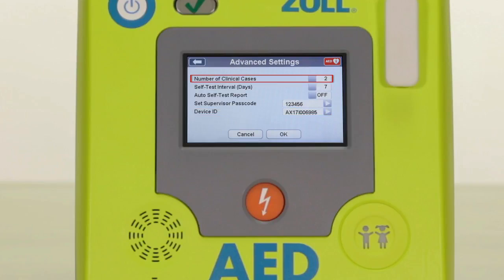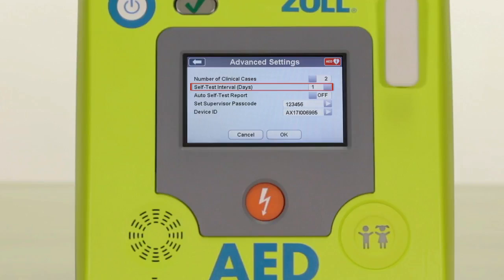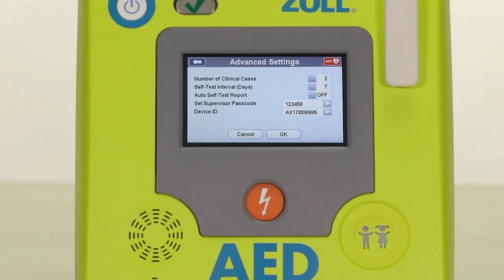The AED3 stores up to two clinical cases and can do self-tests either weekly or daily. We recommend that the default settings of saving two clinical cases and weekly self-tests be left as they are. The ability to store two clinical cases helps reduce the potential of accidentally writing over case files, and weekly test intervals conserve battery power.